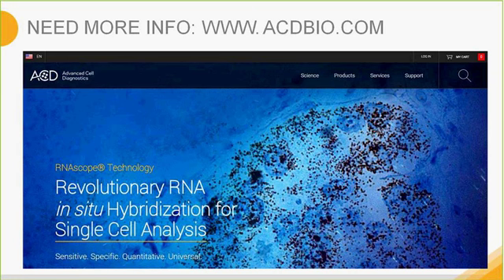So one question that's come in is, would older probes from RNAscope 2.0 work with the new 2.5? For the manual chromogenic red and brown kits, the RNAscope 2.0 probes will work. For the LS and VS RNAscope 2.5, you will need 2.5 probes. So please do contact your sales rep for further information.